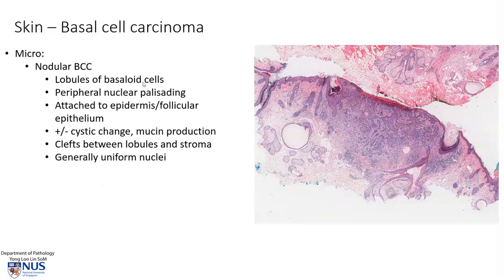Microscopically, nodular basal cell carcinoma, which is the example that we just saw, is composed of these islands or lobules of basaloid cells with peripheral nuclear palisading. It is attached to the overlying epidermis or the epithelium of the hair follicles.